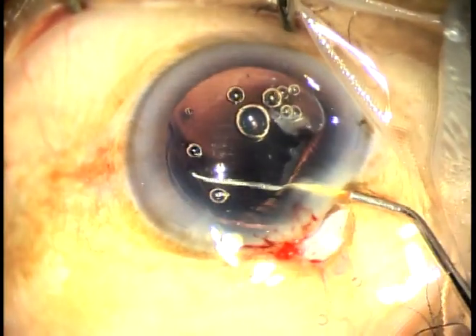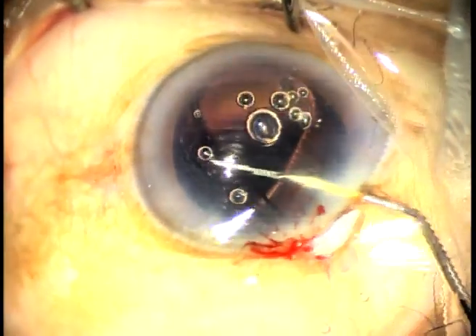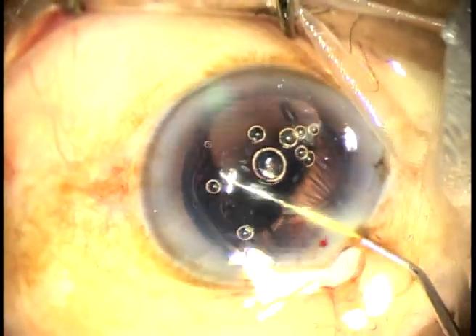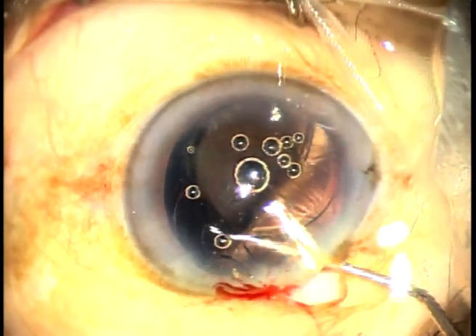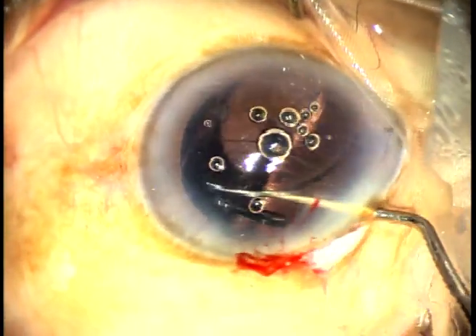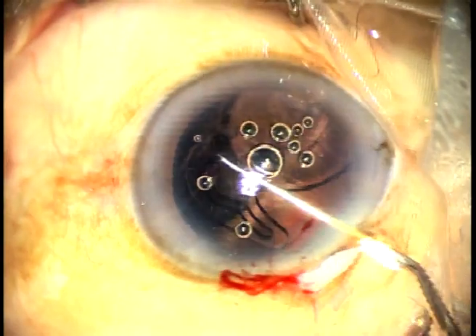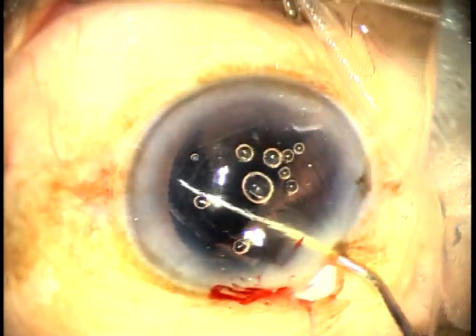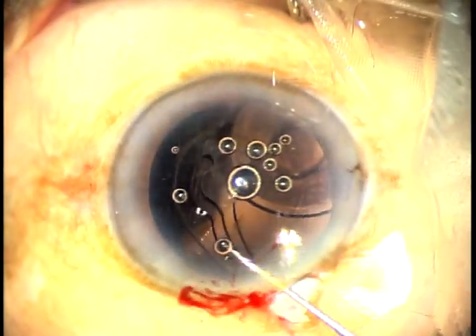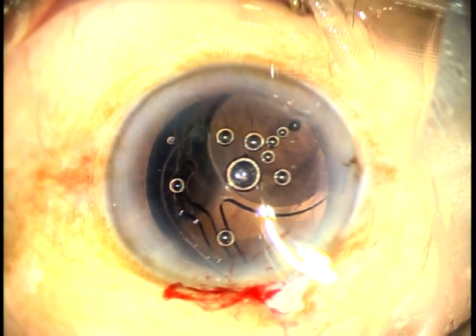Just here, as he pushes, the posterior capsule gives way. A part of the lens is now in the anterior vitreous, and the trainee doesn't have any idea that the IOL may drop.